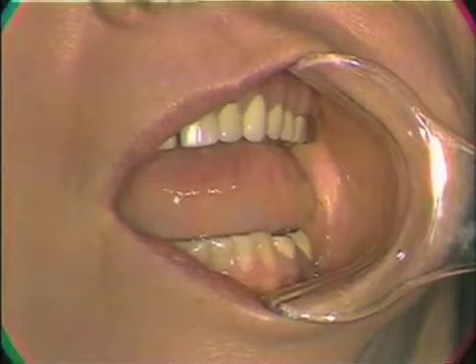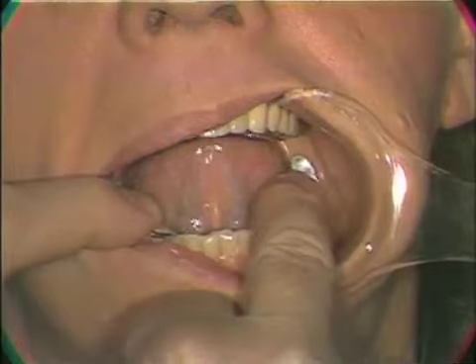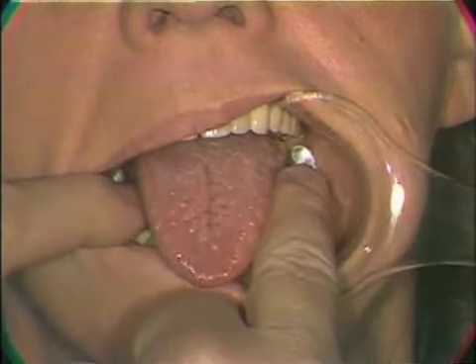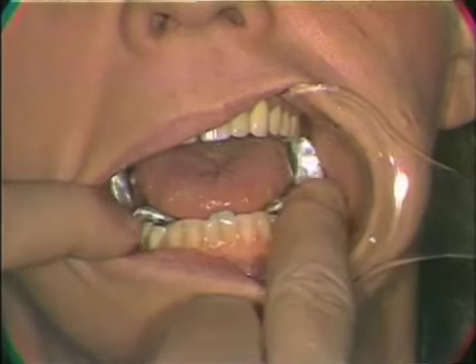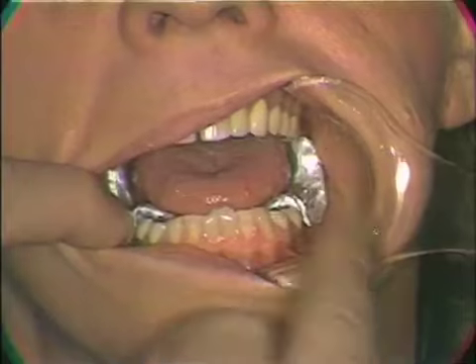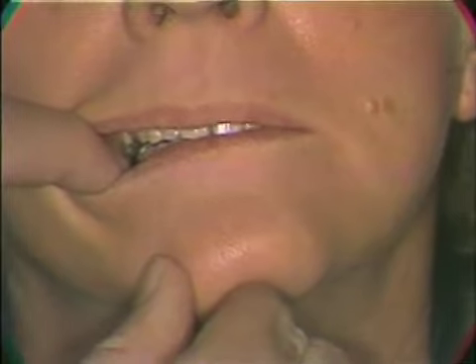The tray is seated in the mouth with the impression material on the tray. The tray is held in position. The patient sticks the tongue way out, and then they bring the tongue back slowly to where it rests behind the lingual surfaces of the lower anterior teeth. It fills the floor of the mouth. And then the patient brings the teeth together, close, right down together, and contact, and then the lips would come together and the tissues at rest. There should be no bulging of the tissue, and the peripheral tissues are at rest.